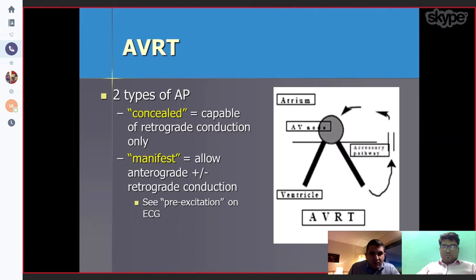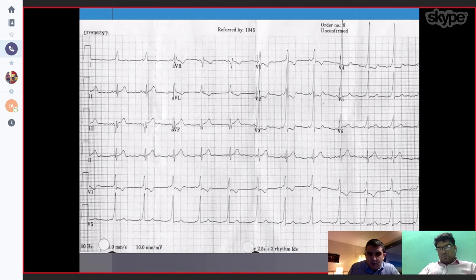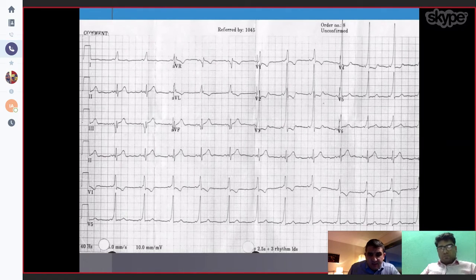For AVRT, there are two types of accessory pathways: concealed and manifest. A concealed pathway is capable of retrograde conduction only, while a manifest pathway allows both antegrade and retrograde conduction. On the ECG, a short PR interval of less than 120 ms, a wide QRS, and a delta wave can be seen. In this case, the accessory pathway appears to be lateral.